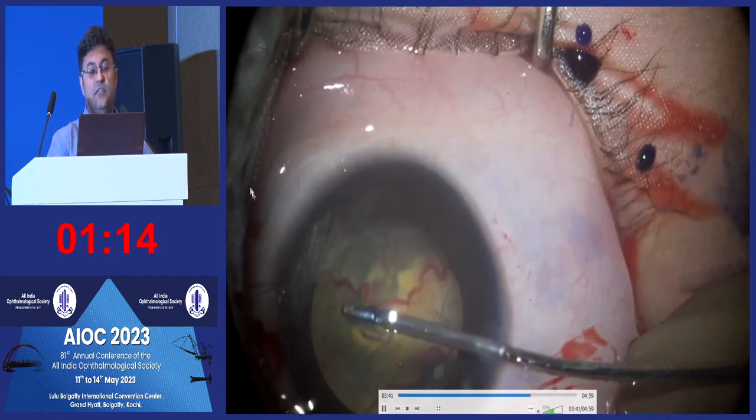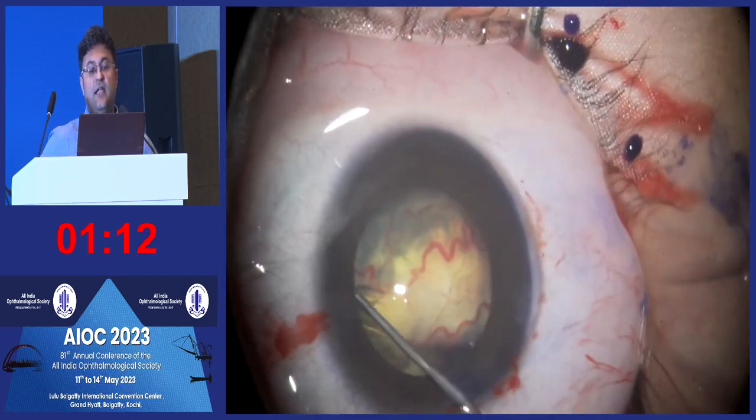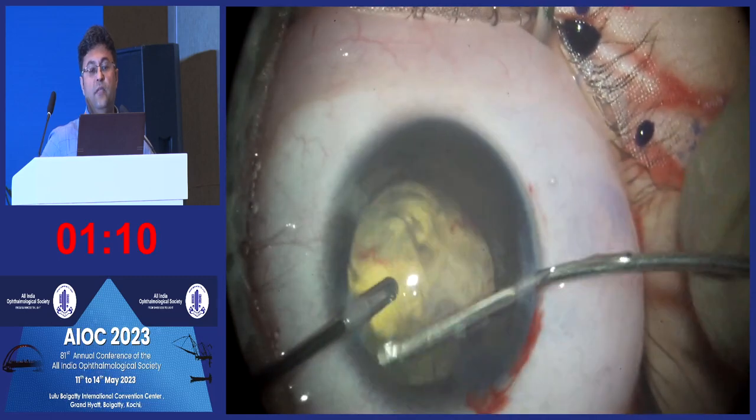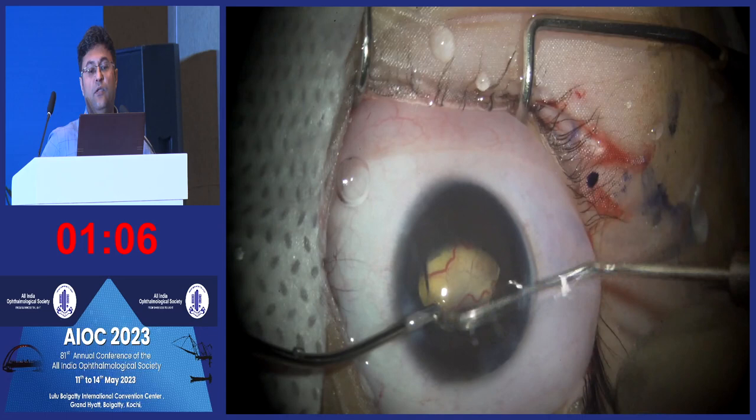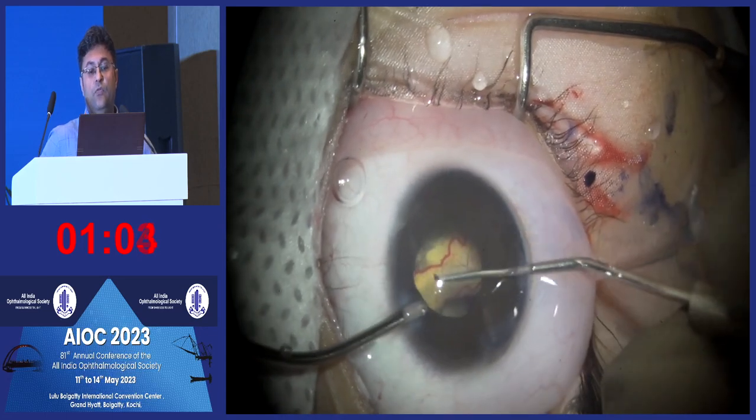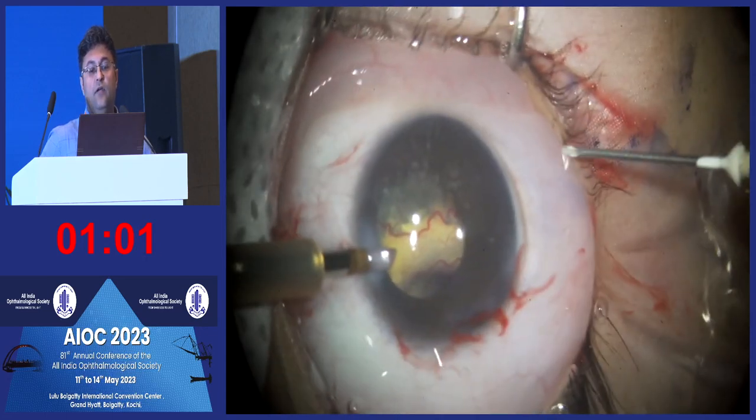This is the last of the series of scintillating cases. There's a cataract surgery being done for what you see beneath the cataract, which is Coats disease, where the retina is looking right at you and touching the posterior capsule. So we cannot intervene here without doing the cataract.